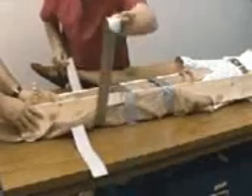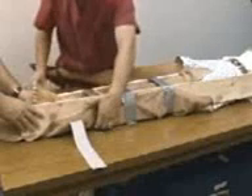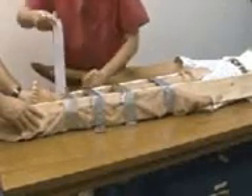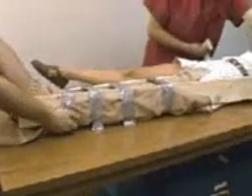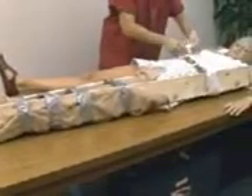Avoid tying directly over the fracture site. One final bandage should secure the outer splint to the victim's torso. A properly applied immobilization can lessen the risk of further injury.